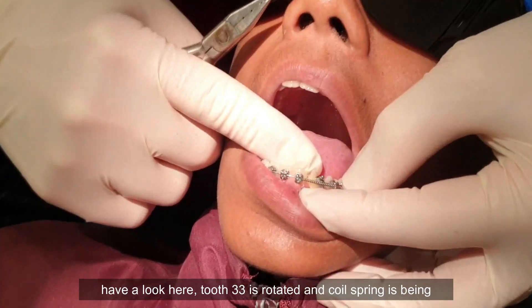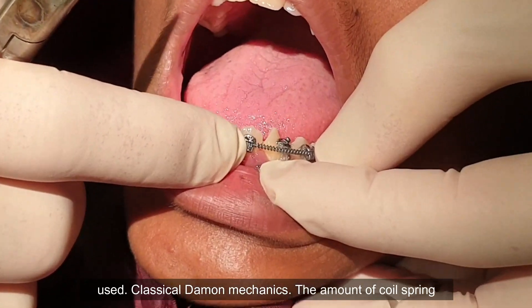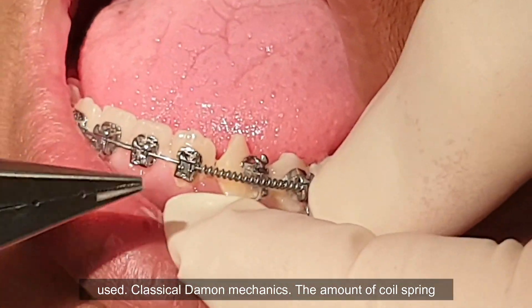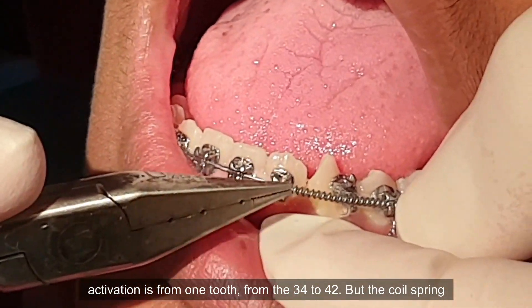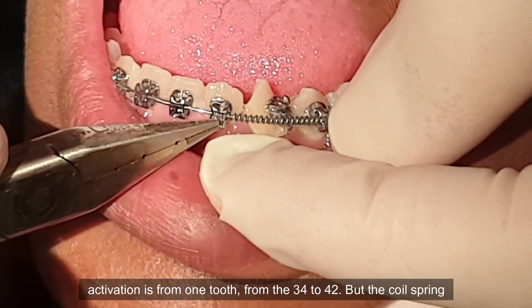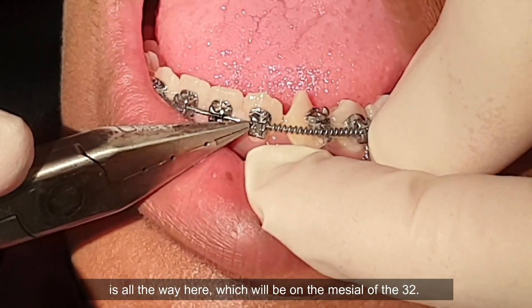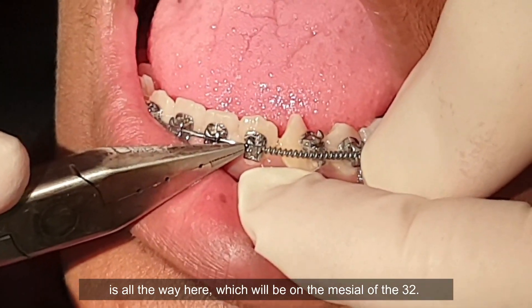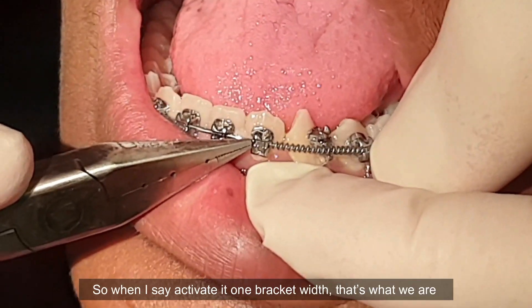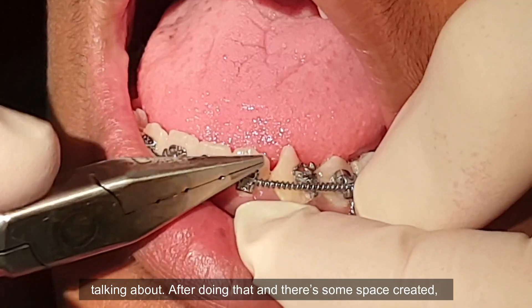If we have a look here, tooth number 33 is rotated and a coil spring is being used — classical Damon mechanics. The amount of coil spring activation is from one tooth to here, from the 4 to the 2, but the coil spring is all the way here, which will be on the mesial of the 2. So when I say activate it one bracket width, that's what we're talking about.